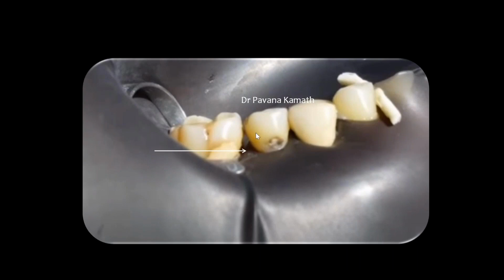Suppose I have a class 2 in this molar, in this premolar, and I have to perform say isolation using a wedge and a matrix band and a retainer. I have enough place, and there is no wing or festoon which is going to interfere with my isolation. So that is what makes the wingless clamp very useful.